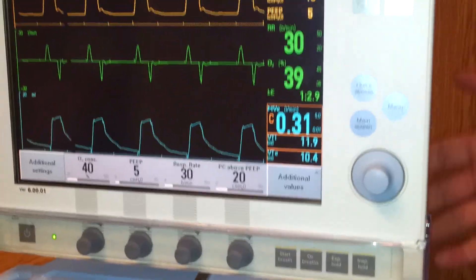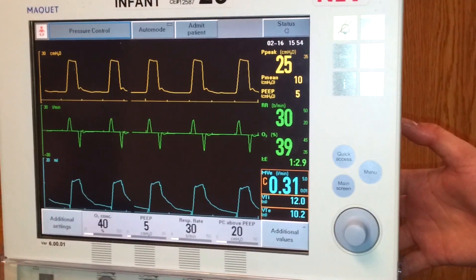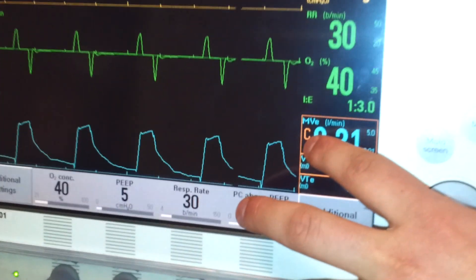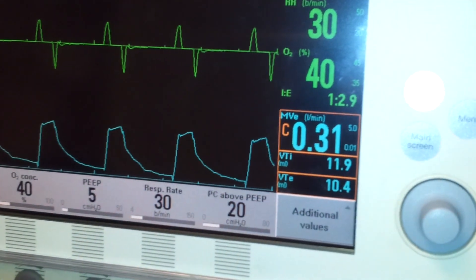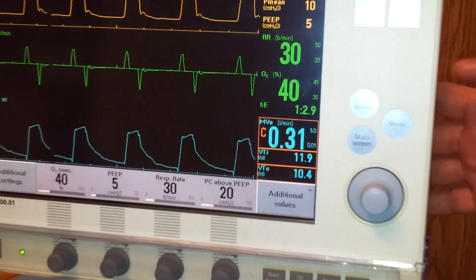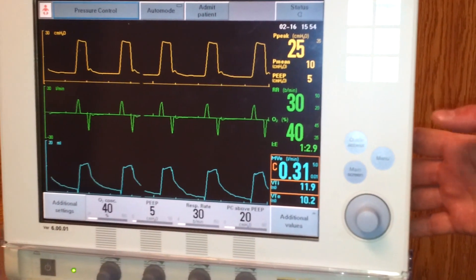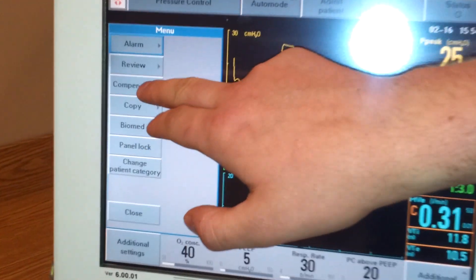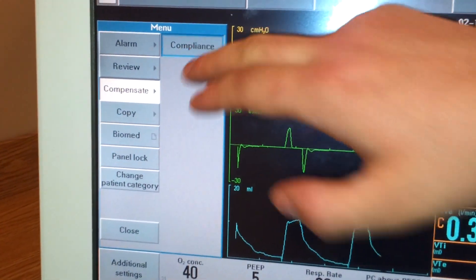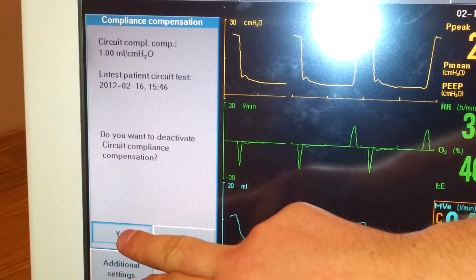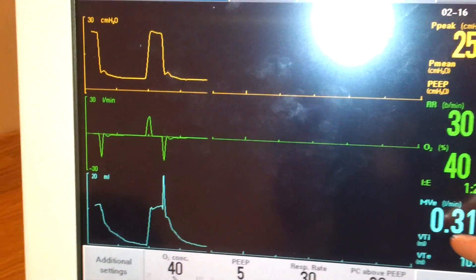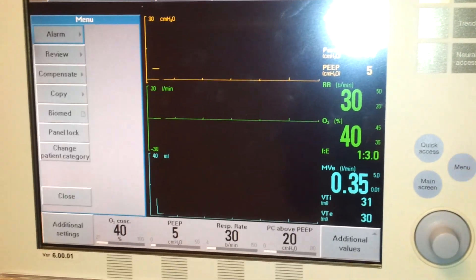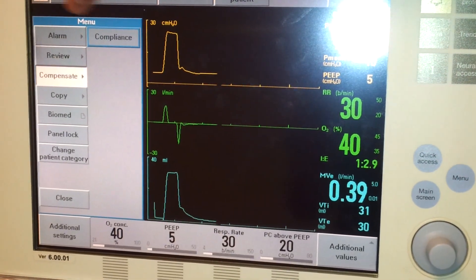This is the Servo-I. It's already passed its pre-use check and it's hooked up. We know tubing compensation is turned on because of the little C right here. If you want to turn it off at any point — which we'll go over why you would do that later — you hit the menu button, go to Compensation, then Compliance, and it'll ask you if you want to turn it off. I'm just going to hit yes. You can see the little C is gone, so your tubing compensation is now turned off. I'm just going to turn it back on — same thing: Menu, Compensation, Compliance.